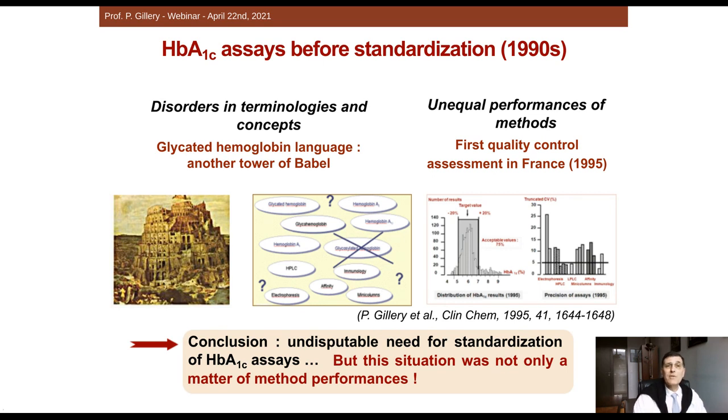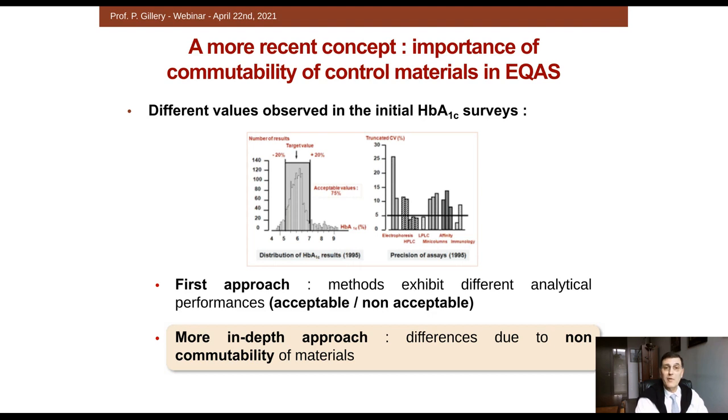If we go back to this slide showing the results obtained before standardization, you remember that we had very different values and that the conclusion was the need for standardization. But the situation observed was not only a matter of method performances.